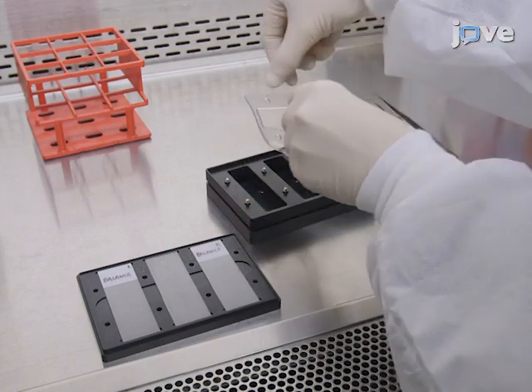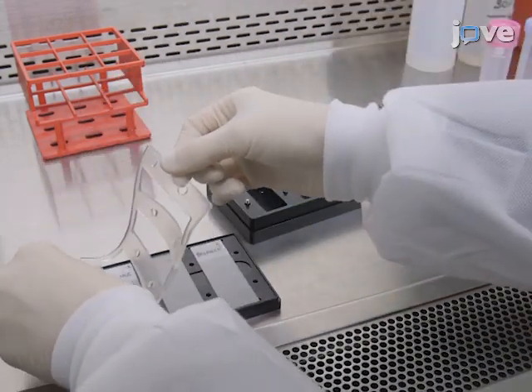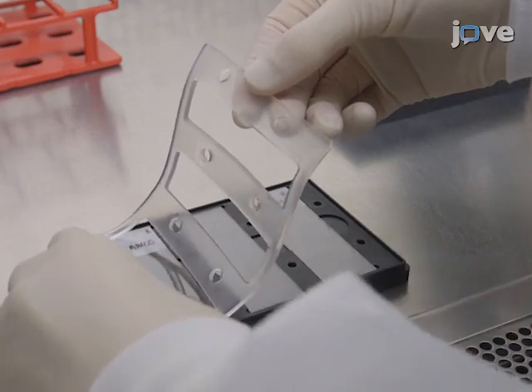Place the glossy side of the seal facing downwards onto the microarray printed surface. To ensure a good position, overlap the screw holes of the seal and the base plate.